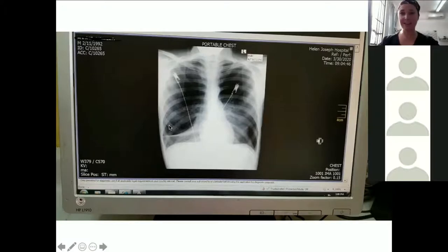The only thing to think about when you put in the chest drain is you want to make sure you're putting it in high enough, because you obviously don't want to get your drain right down here where there's an element of fibrosis. But the fact that this lung has collapsed down so much, the moment you get in that drain, your lung should then start to re-expand again.